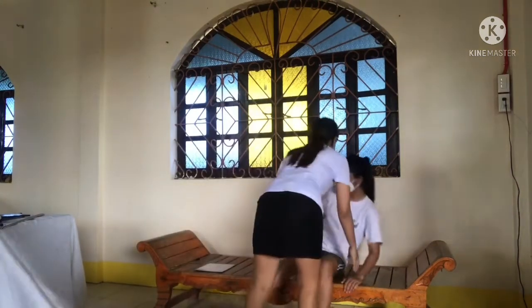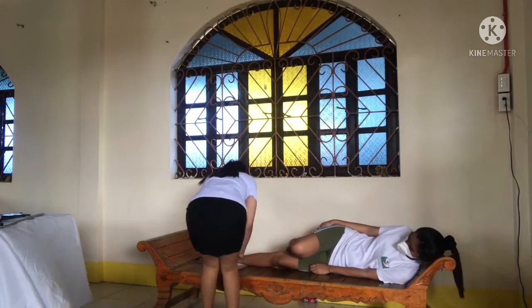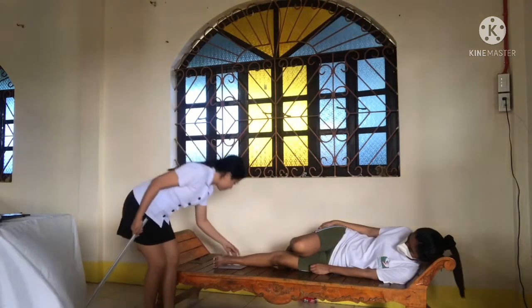So supinate the patient and turn toward the affected side until the ankle is in lateral. So place the long axis of the IR parallel with the long axis of the patient leg and center it to the ankle joint. Ensure that the lateral surface of the foot is in contact with the IR.